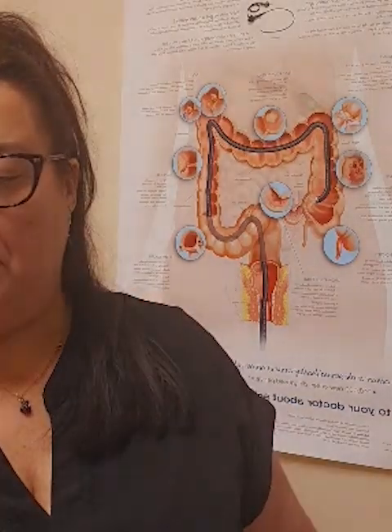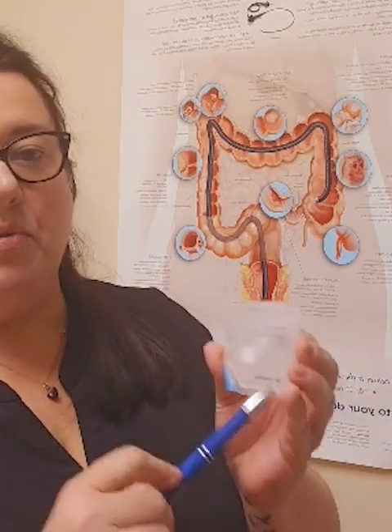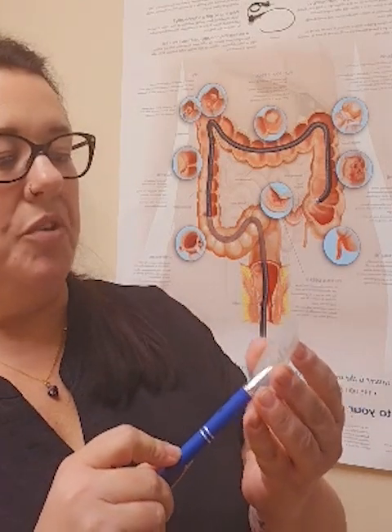Same if you needed the strip paste, or the molding rings, and like this molding ring is a different company, you could give whatever that is with the reference number, and then that office can order those supplies for you to the durable medical equipment store.